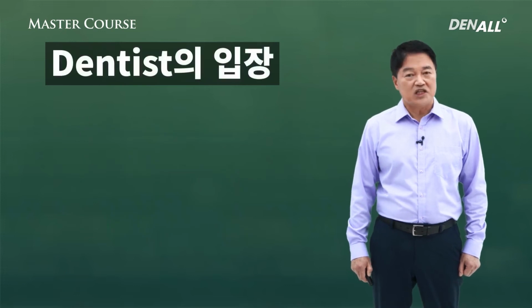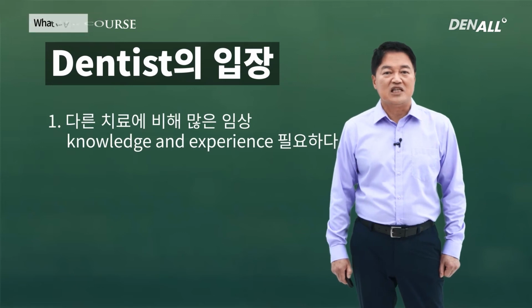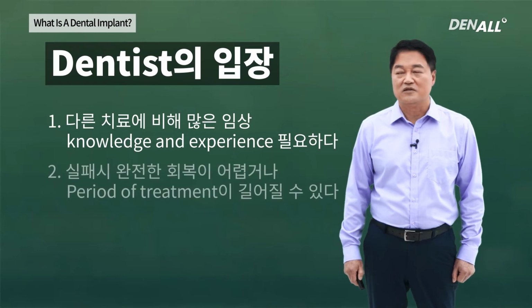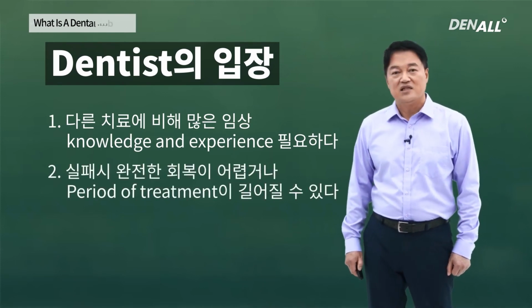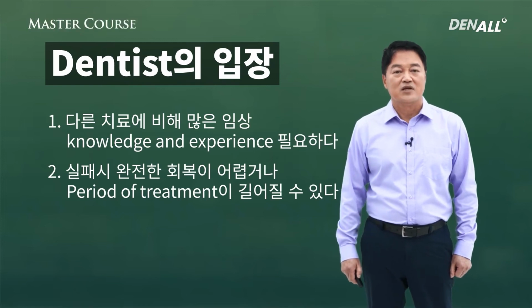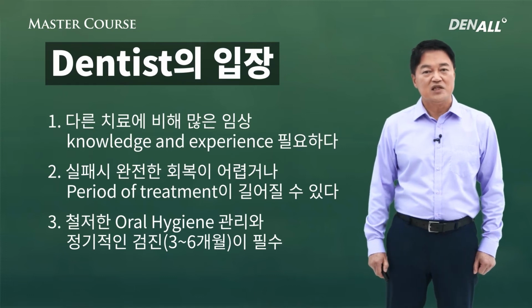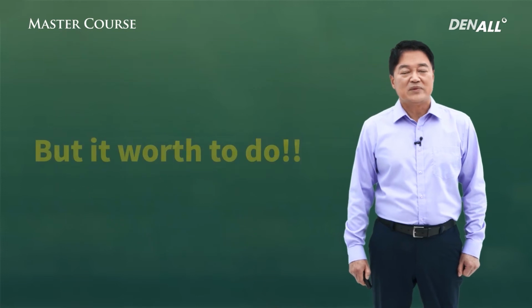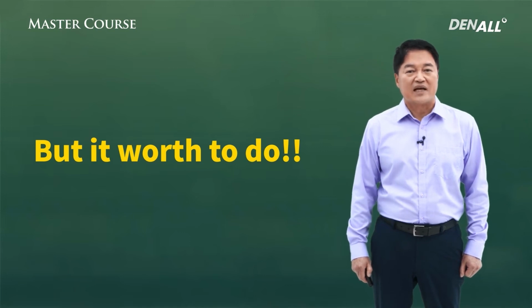From a dentist perspective, compared with other treatment, it requires a lot of clinical knowledge and experiences. Second, if it fails, it is difficult to achieve full recovery or period of treatment can become elongated. Thorough oral hygiene and regular checkup is also essential. However, implant has many advantages and it can overcome such disadvantages.